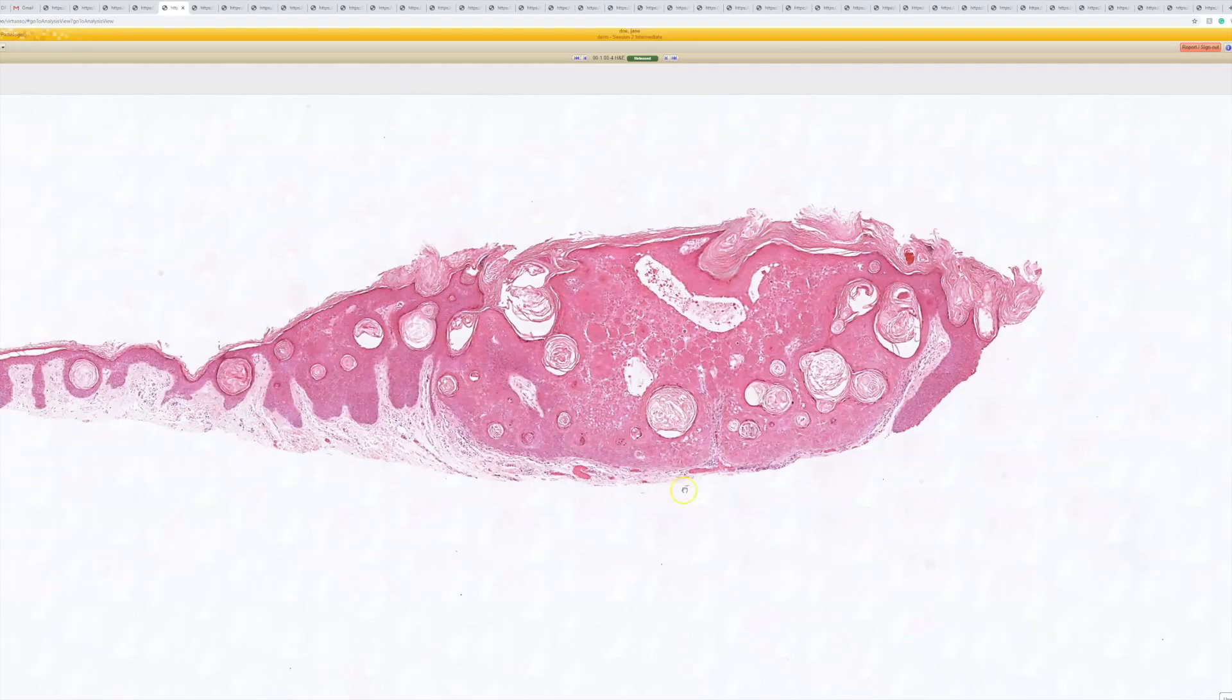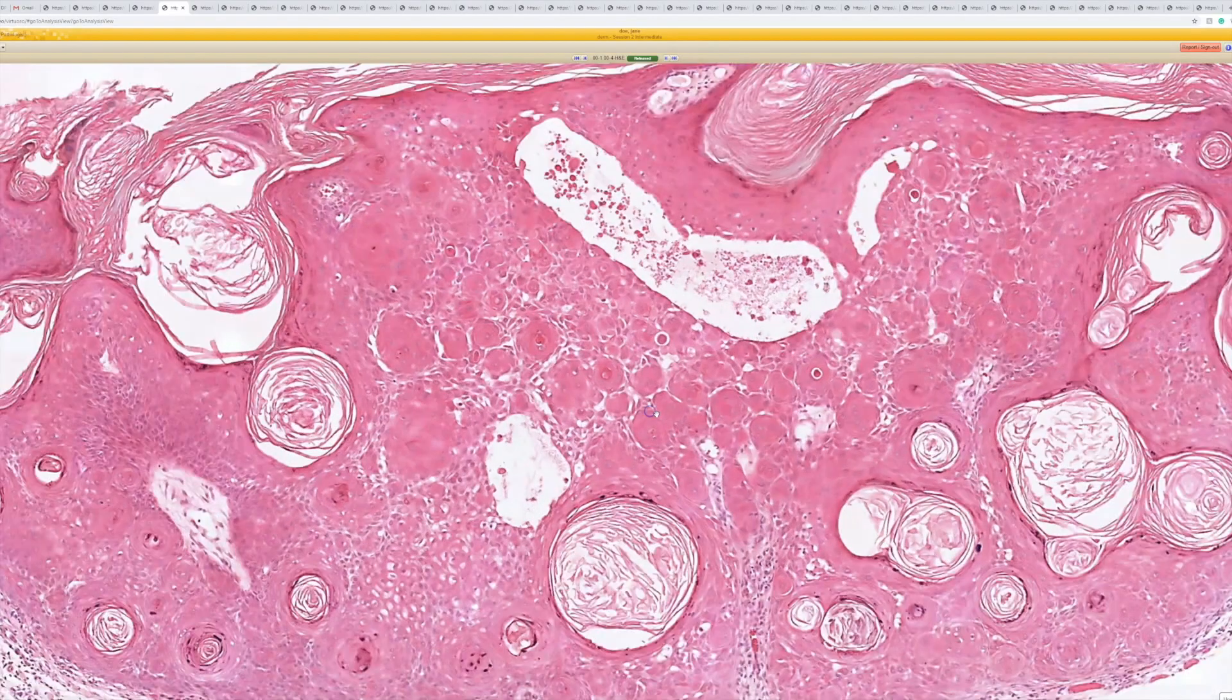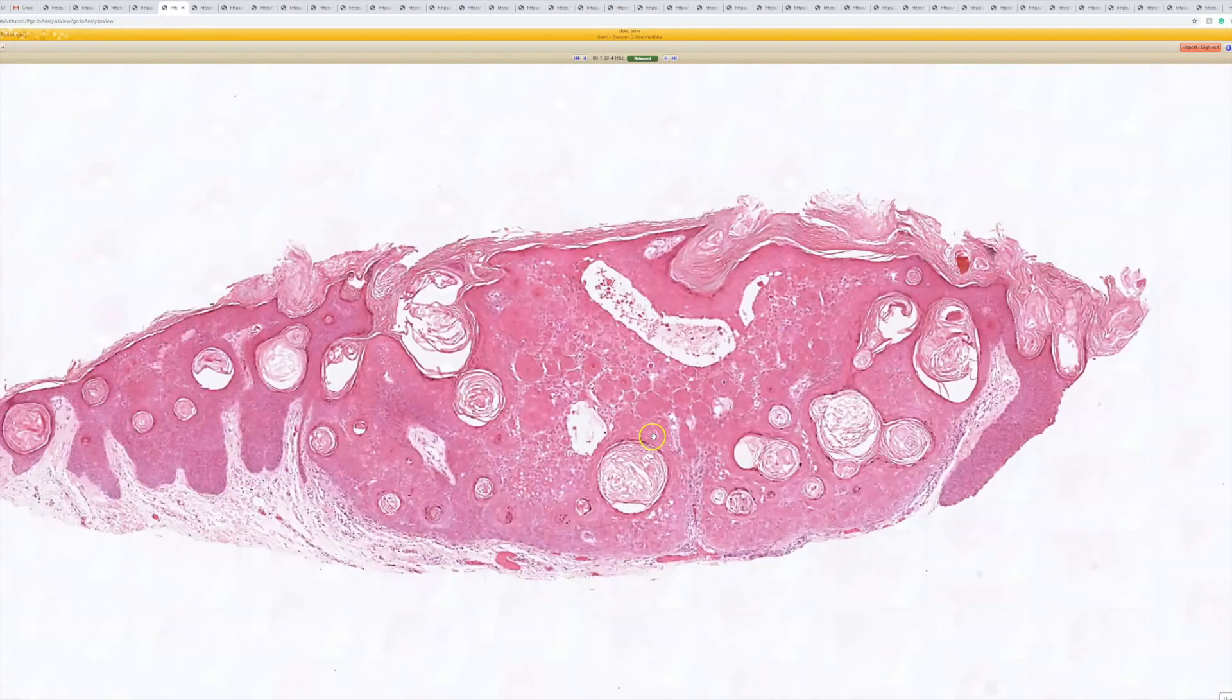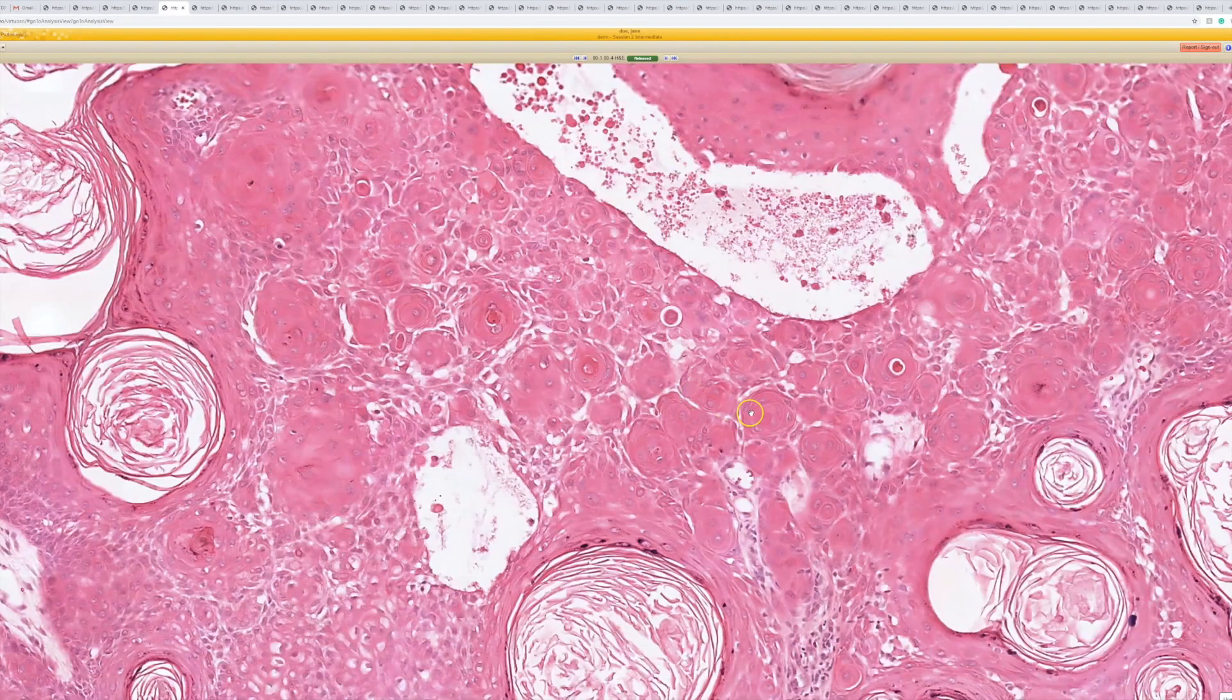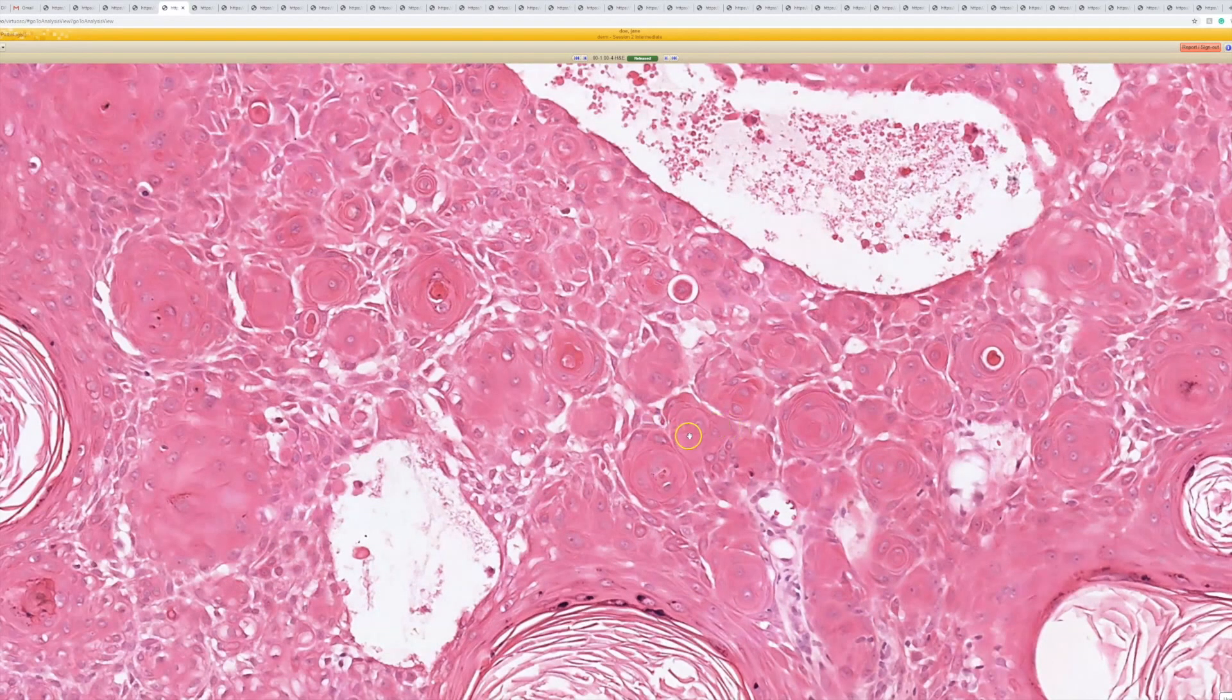I see a lot of squamous eddies, so maybe irritated. Yeah, good. It's a perfect acanthotic lesion of bland keratinocytes with nice horn pseudocysts, so it's a seb, and when you get a seb plus the nice swirly, whirly squamous eddies, then that's what you call an irritated seborrheic keratosis.